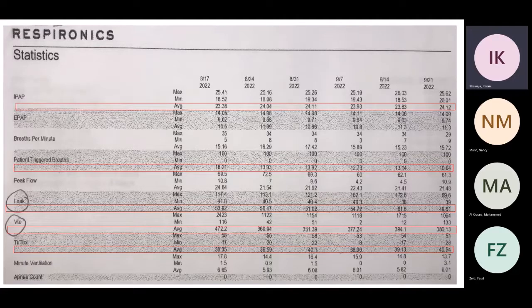So that means the patient is getting more support, okay, which is the backup rate kicking in about 80% of the time for this week and almost 90%. So this is good and bad. Let's go to when we consider it to be bad and when we consider it to be good. She didn't give me any specific number and there is no agreement, okay, but we need to keep it on the low side. And this is what I told her in my explanation. She's in full agreement, but she doesn't know exactly any number. Just keep it on the low side.